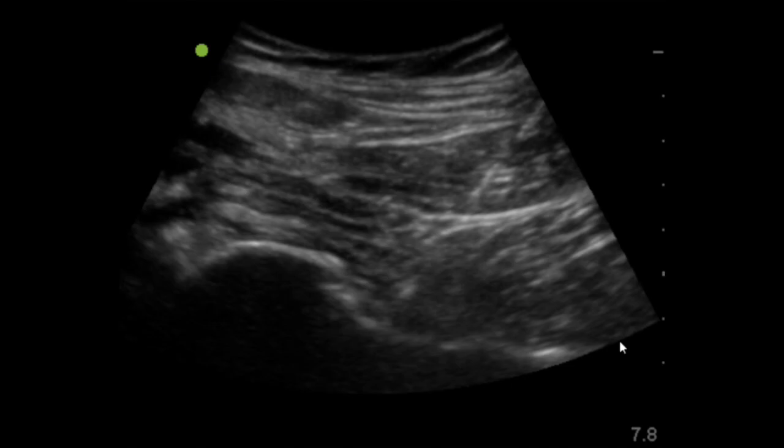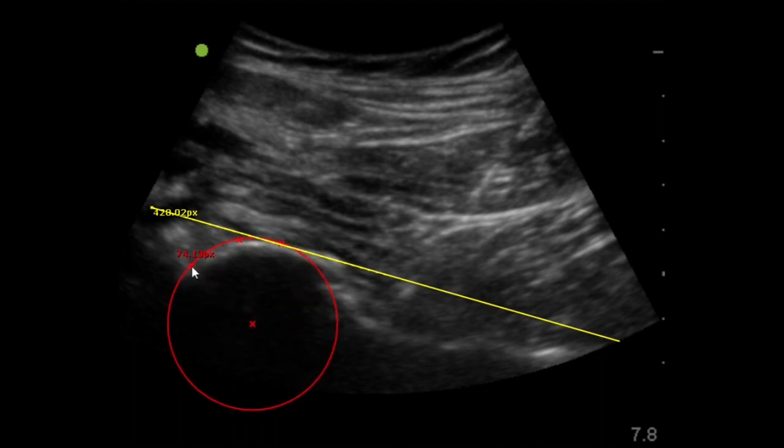First, the distalmost point of the joint capsule insertion is identified, and a tangential line to the spherical femoral head is drawn. This line approximates the central axis of the femoral neck used in radiographic measurement. Next, 3 points are placed along the visible portion of the head, with as much spread as possible to improve accuracy. Points should be placed on the concentric portion of the head to avoid erroneously including the cam deformity. These 3 points are used to form a perfect circle.